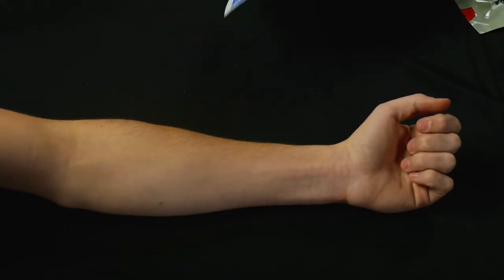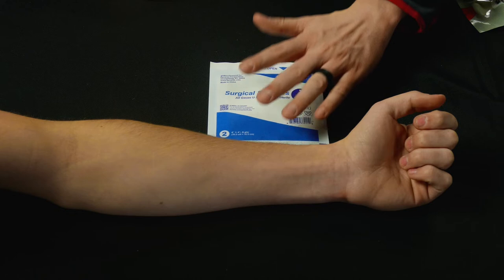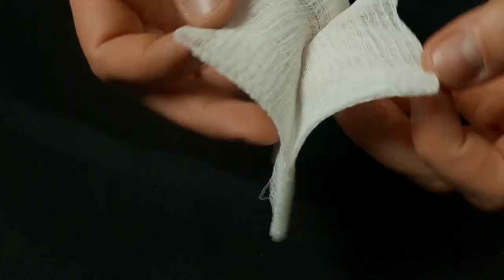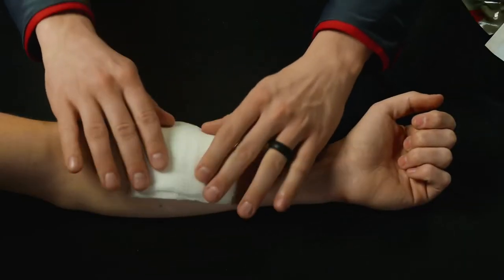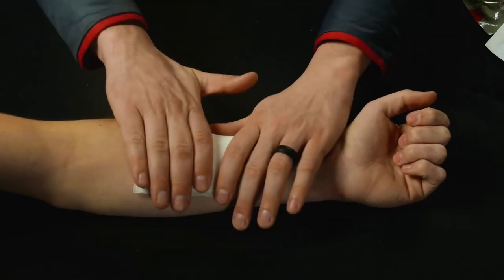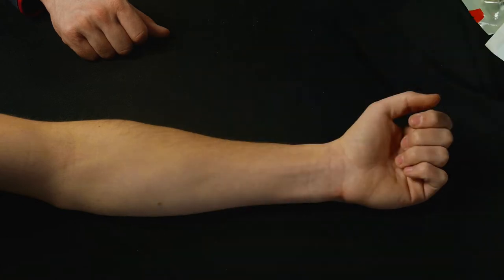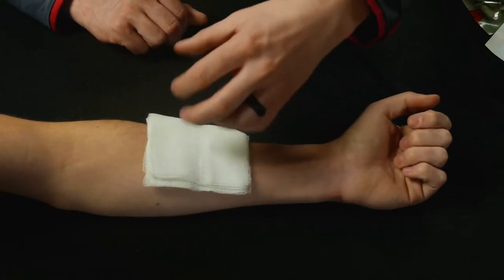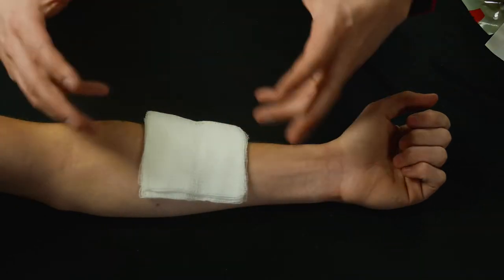When addressing the wound, 4x4 gauze pads are very common — for hospital use, ambulance use, and for people to keep in first aid kits. There are two in each pack. If one is not enough for the amount of bleeding, double them up and stack another on top so you have enough gauze to absorb the bleeding. If they get saturated, add another on top. Keep in mind it's not always a good idea to yank the gauze off and rip all those clots away before putting more on. If clotting has started and you still have some seepage, just add additional gauze on top.